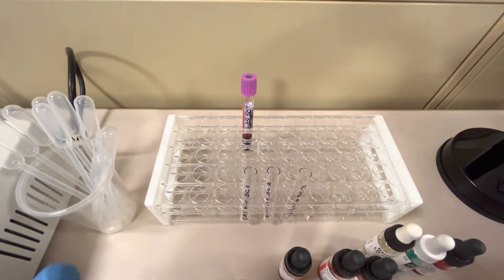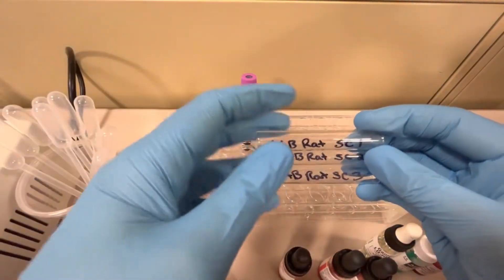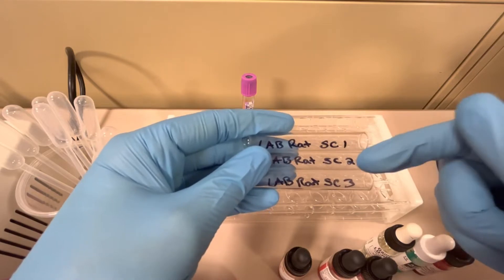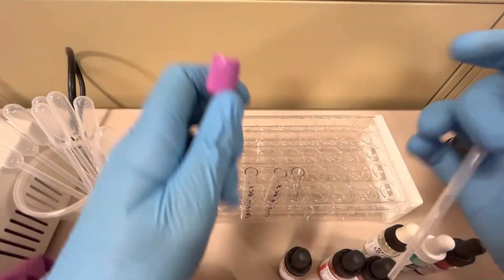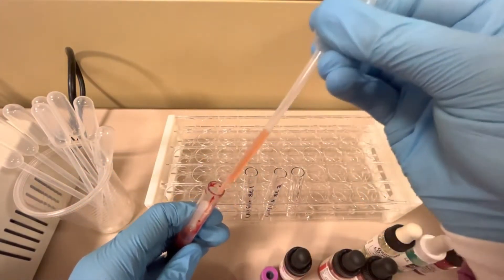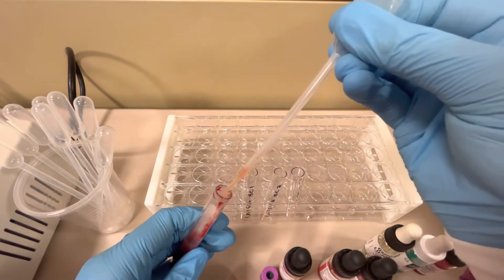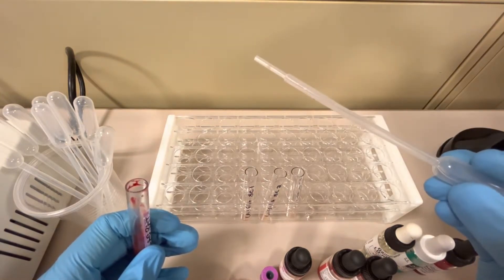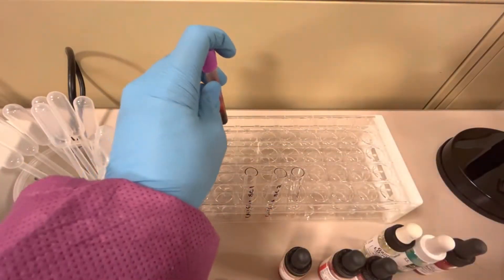I have three tubes labeled with the patient's identification — 'Lab Rat,' the patient's first and last name — and labeled SC1, SC2, and SC3 for screening cells one, two, and three. The first step is to take one disposable pipette, remove the cap from the sample, and put two drops of patient plasma into each of those tubes. Discard the pipette into the biohazard container and replace the cap — never leave the sample open.